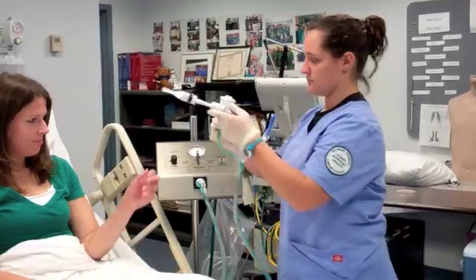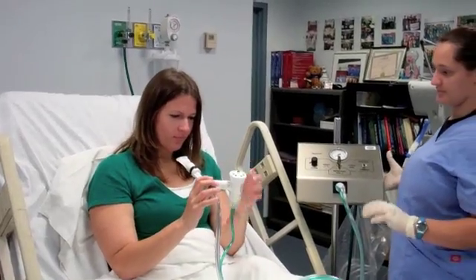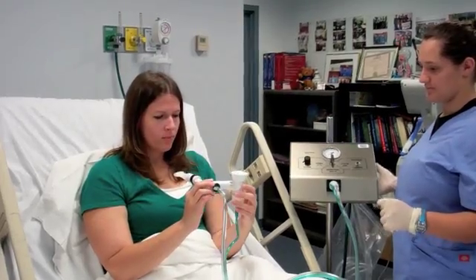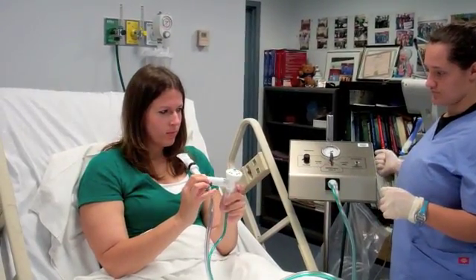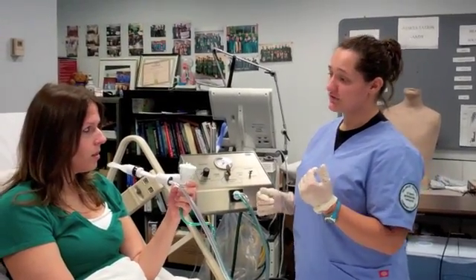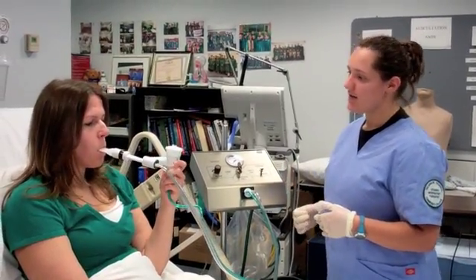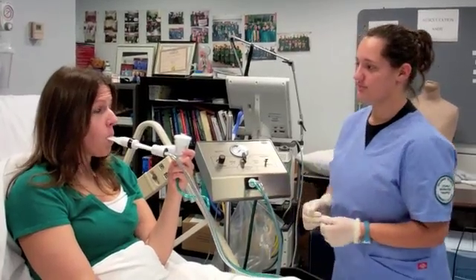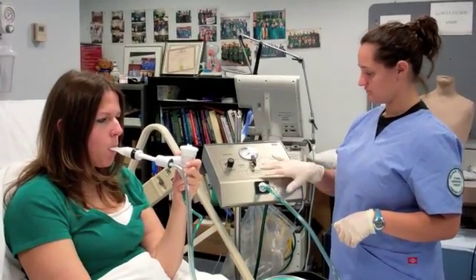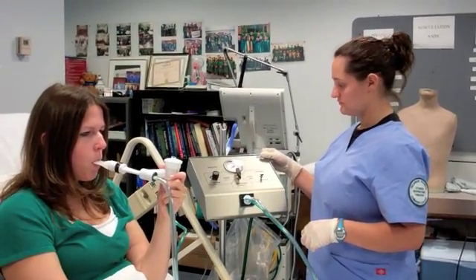Hand the mouthpiece to the patient or place the mask around their head. If using the mouthpiece, make sure to tell the patient to keep a tight seal around it and breathe in and out through their mouth as normally as possible. Tell them: 'I need you to make a tight seal with your lips around the mouthpiece. Breathe in and out normally and keep your cheeks clenched.' Once turned on, start it on the first mode, aerosol, and make sure the patient continues breathing at a normal pace.